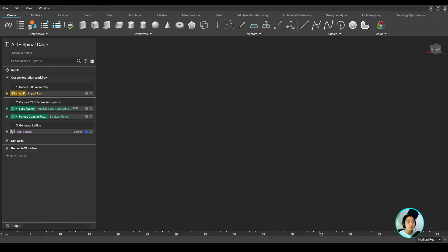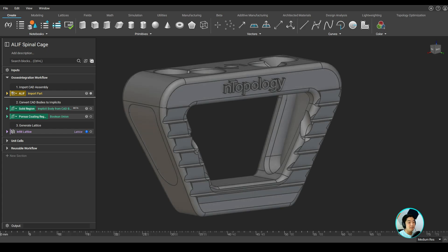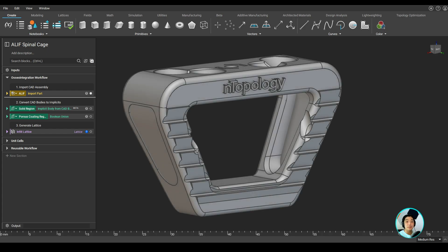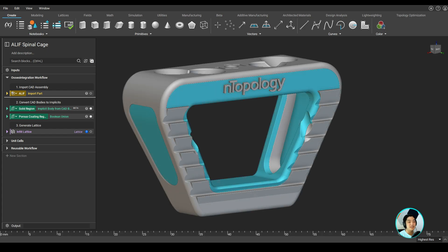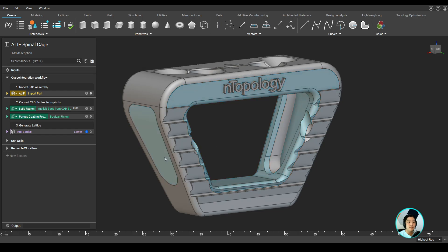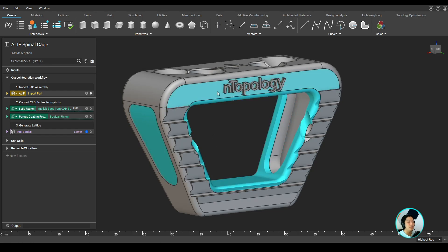To start off, I imported my CAD assembly. In this case, I'm going to bring in my ALIF model, which I have pre-segmented into solid and porous coating regions. Once I've imported them, I can convert these CAD bodies into implicit bodies in nTopology's native format.